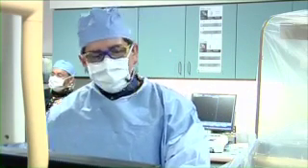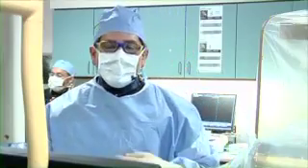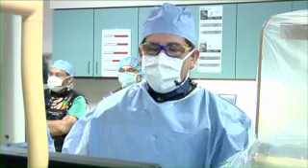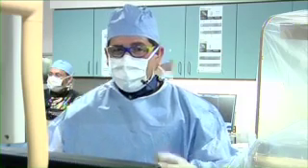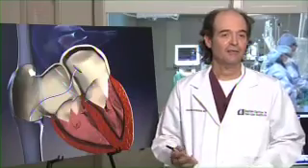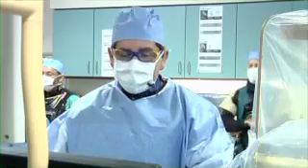Another good question here: will I feel the device once it is in place? No, you will not feel the device. But because it's a foreign body in your heart, in the first few weeks there's about a 5% incidence that you can have palpitations, extra beats originating in the septum, in the atrium, because you have the device. But it's usually transient and will go away, with no pain or anything like that. I think that's an important answer. Really, you can't feel it, except for these transient extra heartbeats. It's amazing. You go back to your normal life, and most important, you feel comfortable that you're not going to have other problems.